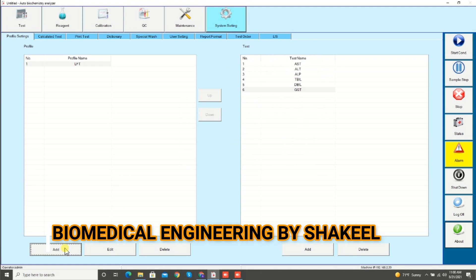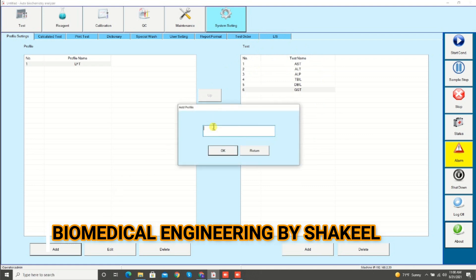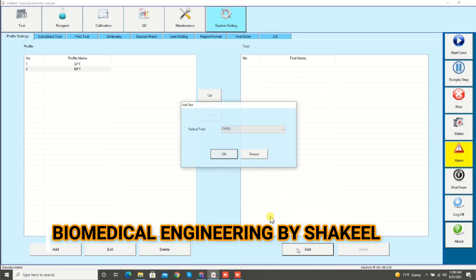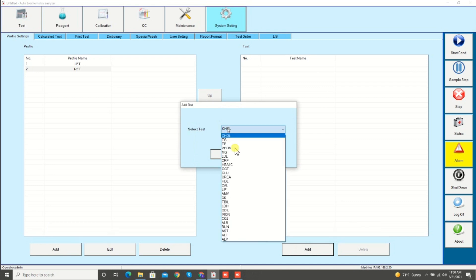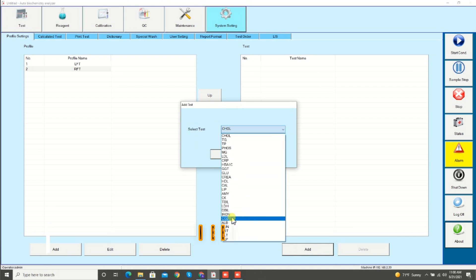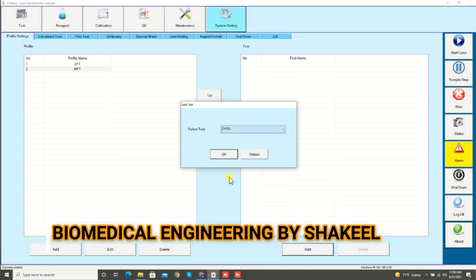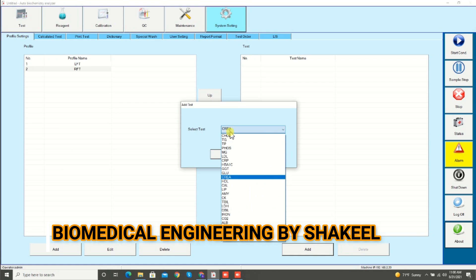Suppose I want to make a profile for RFT — renal function test — click OK. Same as, select the tests: creatinine and urea. In this way we can make a profile and select the tests for it.